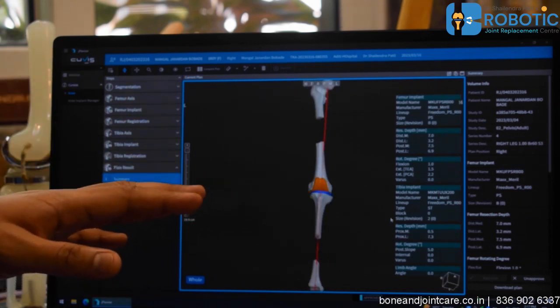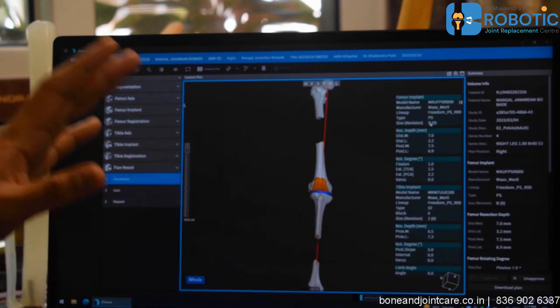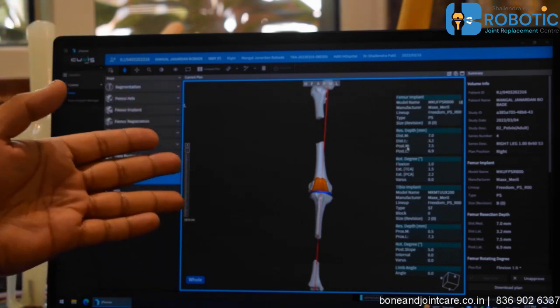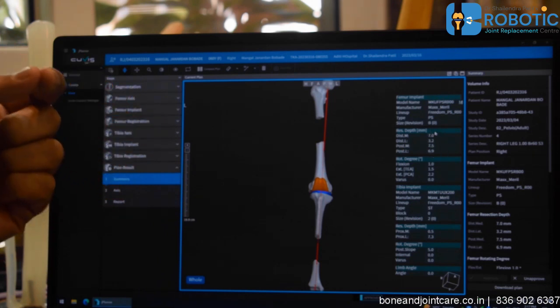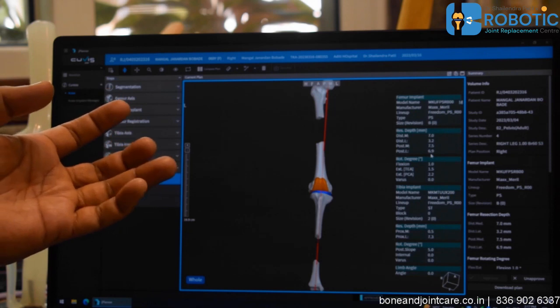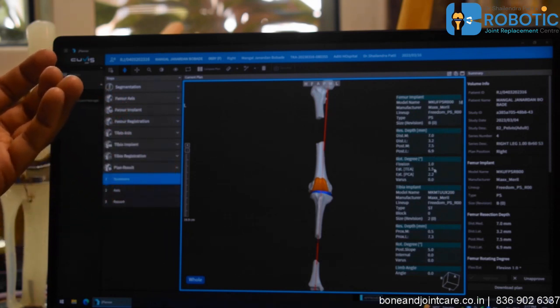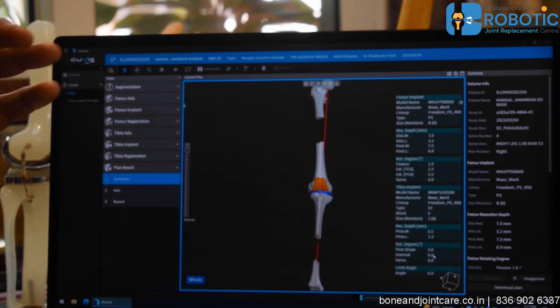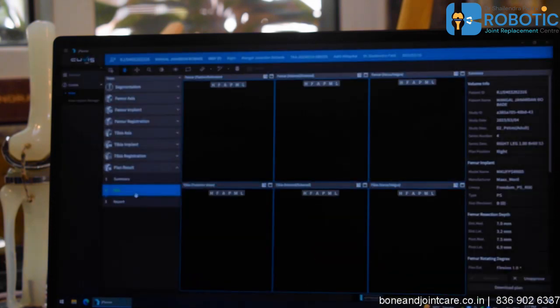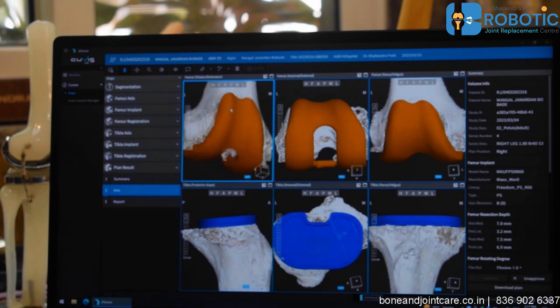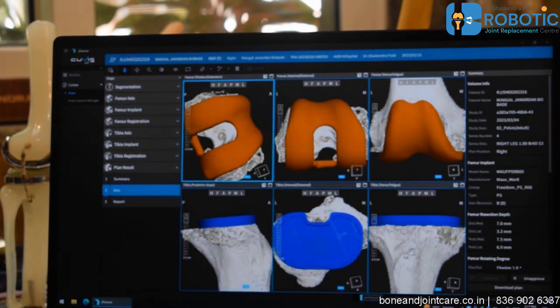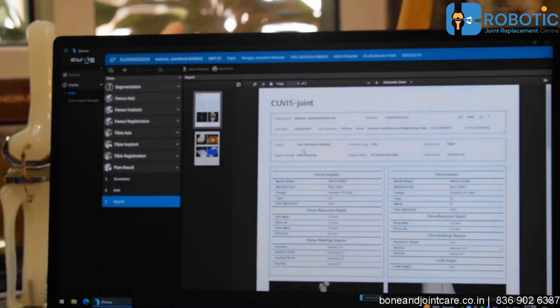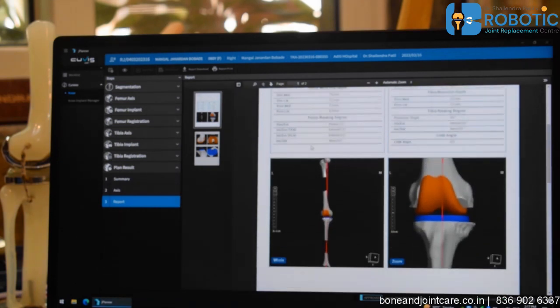All the cut details are shown: we will use size B as the femoral cap, with medial distal and lateral cut values displayed in sub-millimeter precision. Rotation and flexion values are also shown, along with the tibial base plate size. The software allows viewing the cuts one final time in all planes before surgery, and a system-generated pre-planning report is produced.